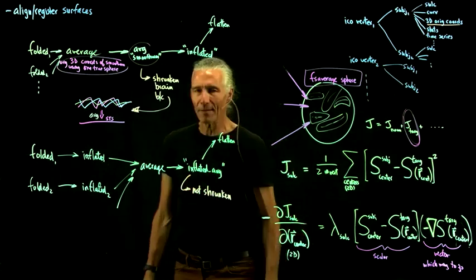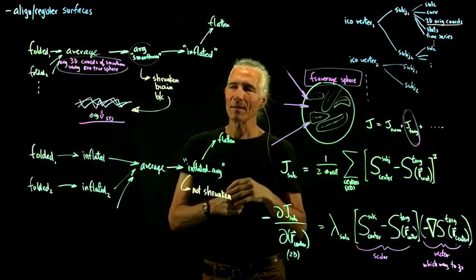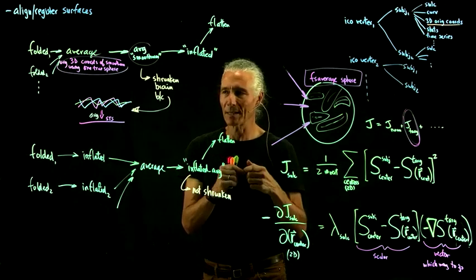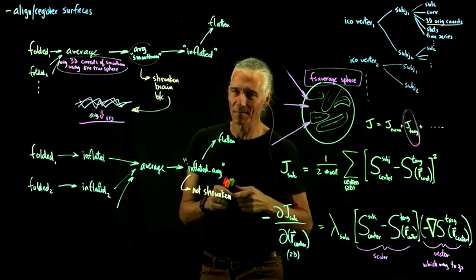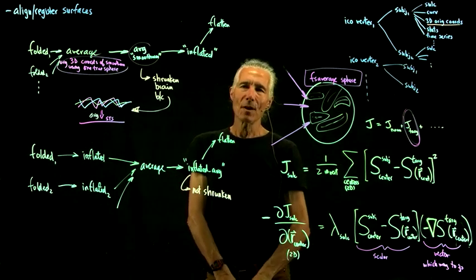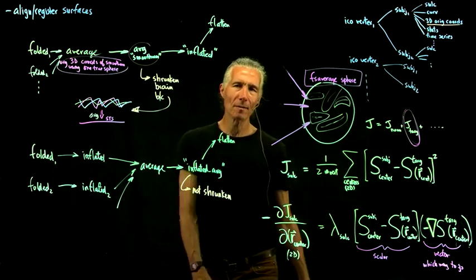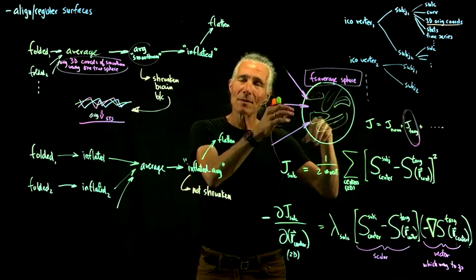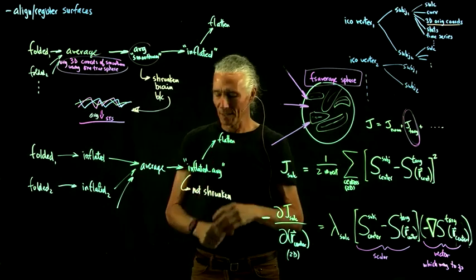And so generally it gives you a big step up in better alignment between different brains, especially in cases where we have some other alternate measure of being able to say where the area is, without just relying on the fact that our alignment picked up the same vertices. That's the main impetus for doing something on the sphere. Obviously, you've got to deal with other parts of the brain that aren't surfaces, like parts of the thalamus or the striatum. So this whole approach is going to need a different treatment for the cerebellum or the cortex versus some area in the thalamus that doesn't have a well-defined surface.